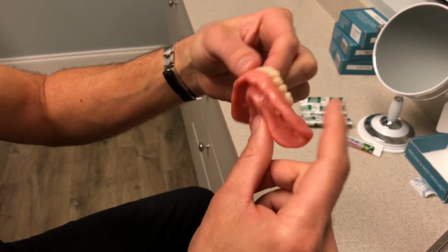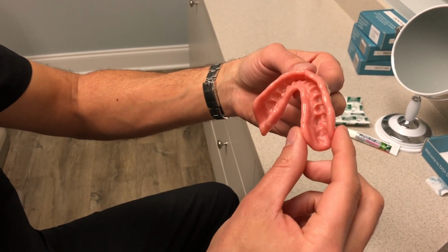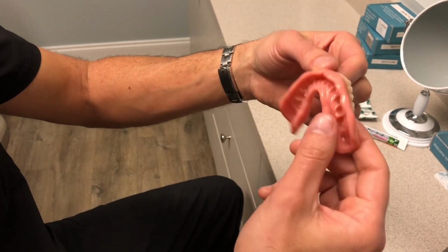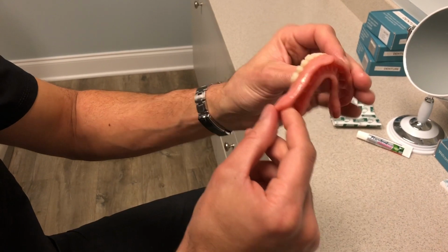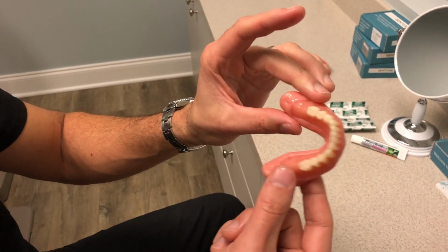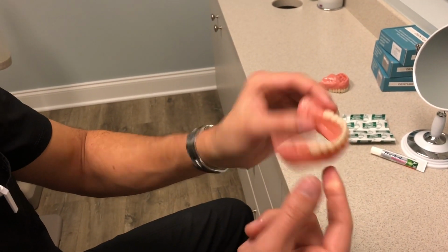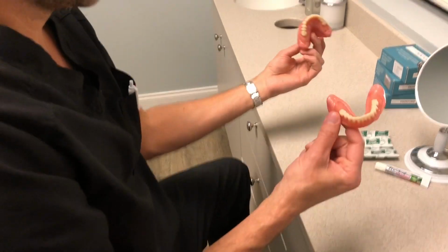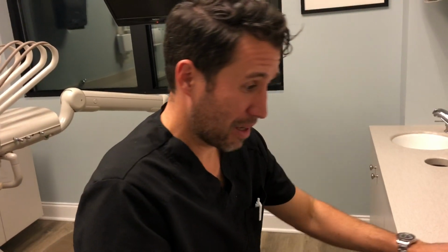You push harder to pull and pull less, depending on how deep of a vertical dimension you want to go with. But that's how that captures there. You can see it completely adapts, fits well, lines up, and then you're good to go. So you've got an upper and lower denture sized up, ready to go. That's it. It's really just that easy.